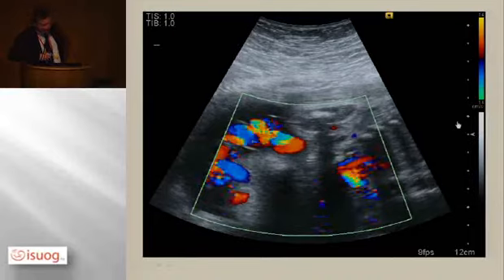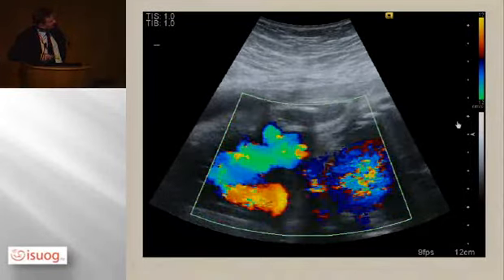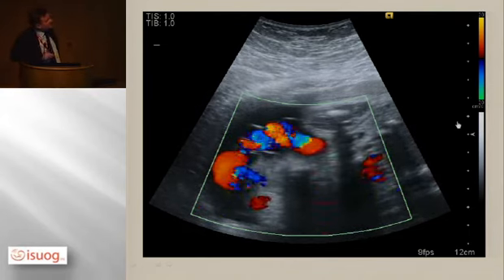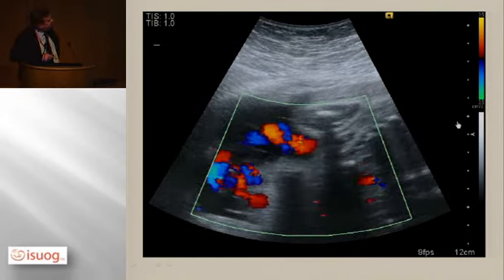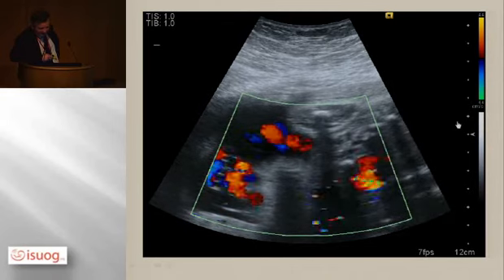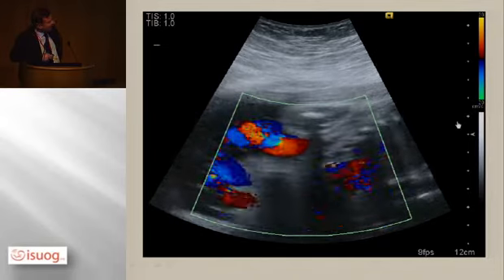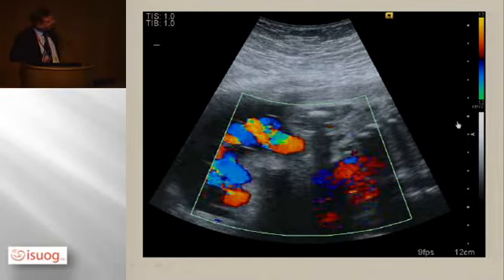All you are seeing is the arteries going to and fro, and we've come right down in velocity again, and everything becomes a mishmash of color. So let's just do that again and just look at the scale here as the image changes. So scale going up, up, up, you're losing the velocity range, but you are seeing directional flow towards and away from the probe. The velocity is now coming back down, and you're getting artifact, but you're also seeing artery and vein all in one image.